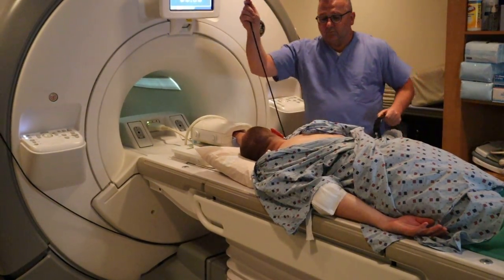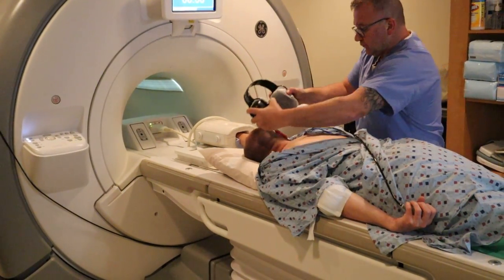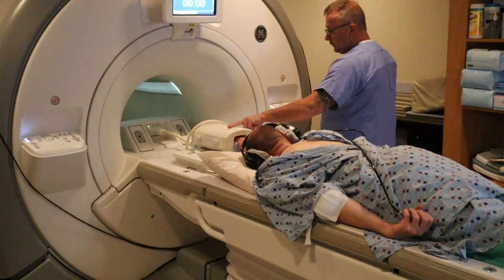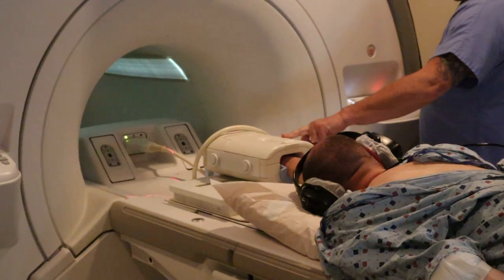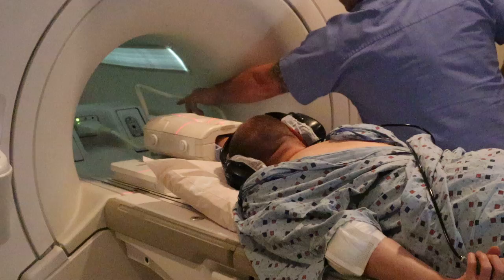Emergency ball for the patient's hand. Headset to listen to music. You're going to landmark, and you're going to advance to scan.